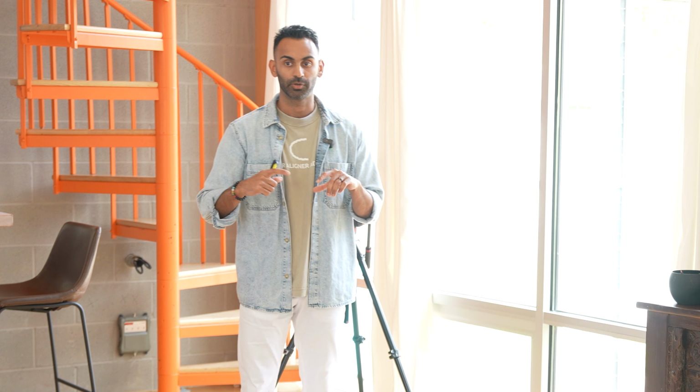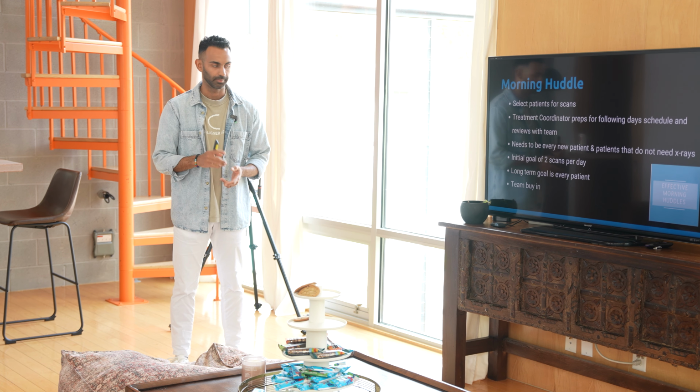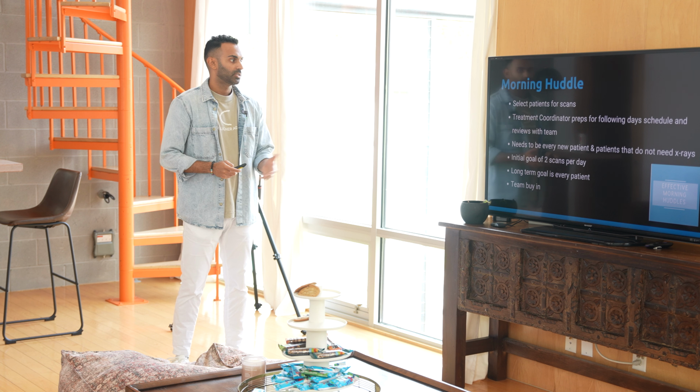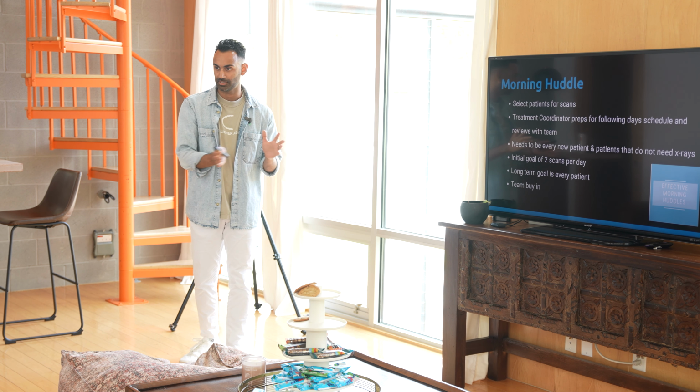But like we said yesterday, scans are part of the record-taking process, and so some type of record should be taken at each hygiene appointment. And so that's why we alternate them. And so when you're talking to your team about scans, you just tell them, look, initially I just want you to have 2 scans per day.